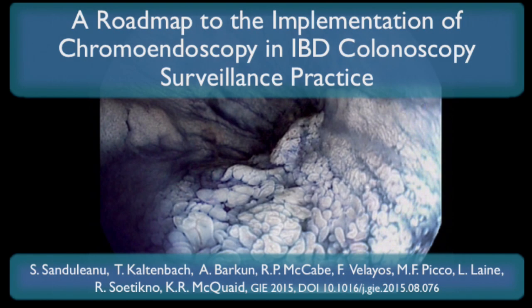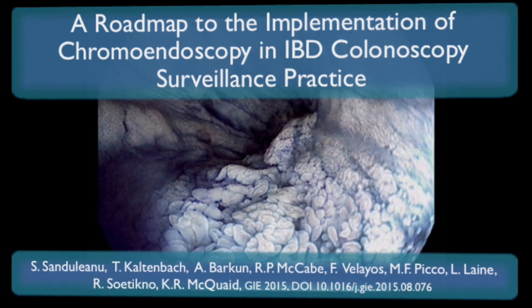Chromoendoscopy with targeted biopsy improves the diagnostic yield of IBD surveillance colonoscopy compared to white light colonoscopy with random biopsy. However, the use of chromoendoscopy is not common in routine clinical practice. In our article entitled A Roadmap to the Implementation of Chromoendoscopy in IBD Colonoscopy Surveillance Practice, we suggest steps for the integration of chromoendoscopy in routine IBD colonoscopy surveillance practice.